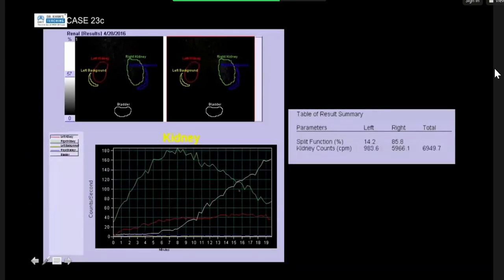So in my institution, we tend to do a delayed image after 30 minutes to see if there's been any drainage. Some places don't, but we tend to do that. And so if you had drawn that out, you'd have called it sluggish drainage rather than true obstruction.